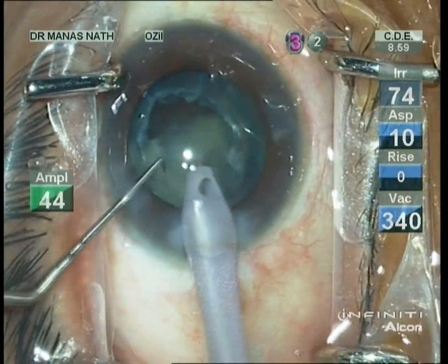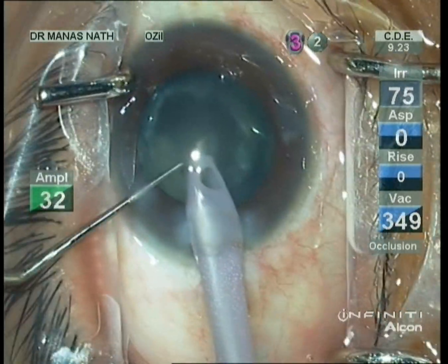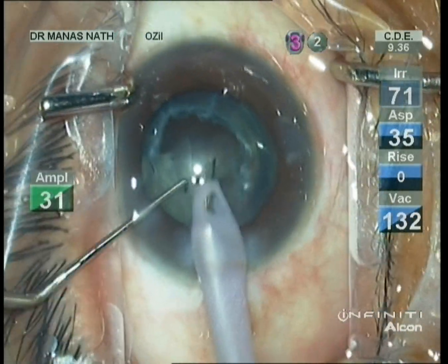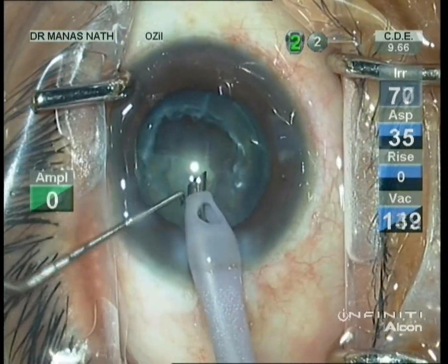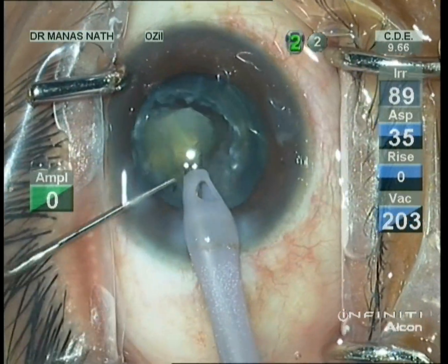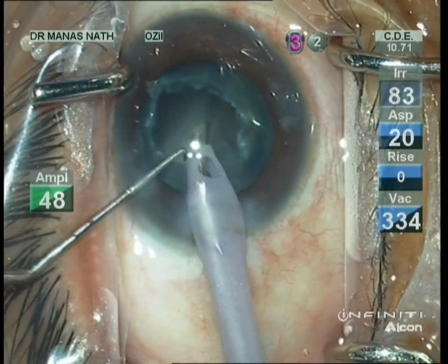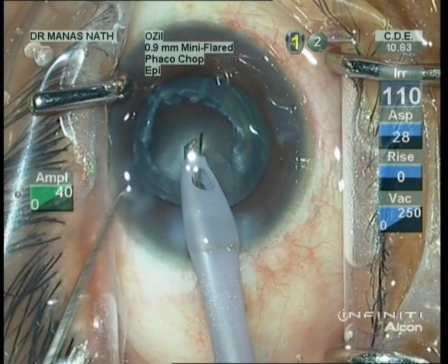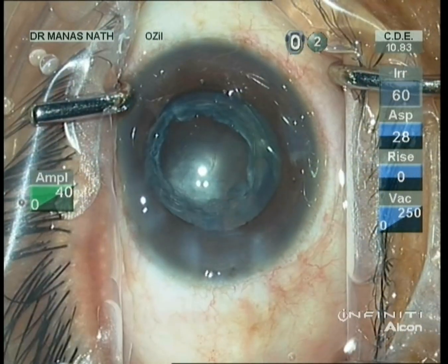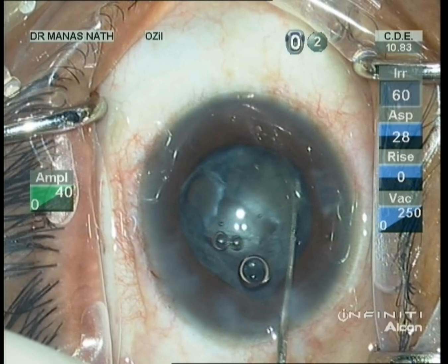Now emulsifying the chopped pieces. The remaining separated pieces were held with the help of the phaco probe and with the help of a second instrument, they were taken out from the bag and emulsified. This is the last piece — without much rotation, the piece has been emulsified.